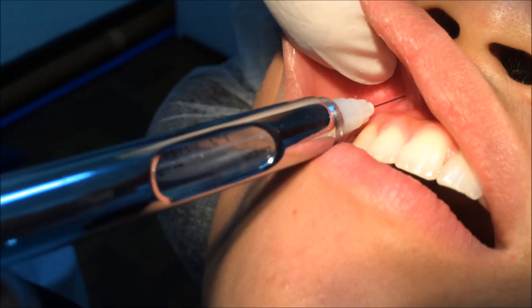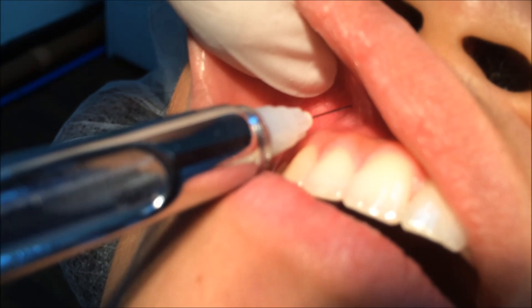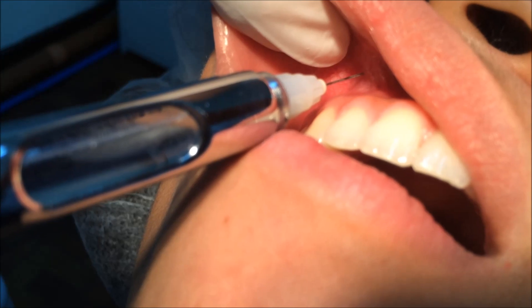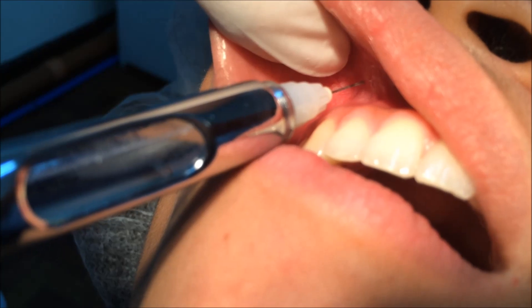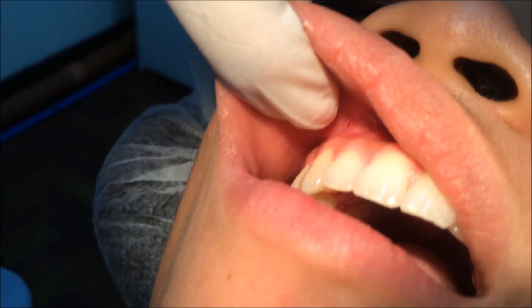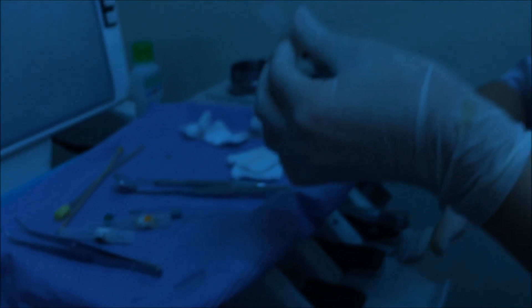Aspirate, and if negative, deposit approximately 0.6 ml — or one-third of the cartridge — slowly over 20 seconds. We deposit slowly so the tissue does not balloon. Then slowly withdraw the syringe and make the needle safe using a scoop technique. Wait 3 to 5 minutes before starting the procedure.